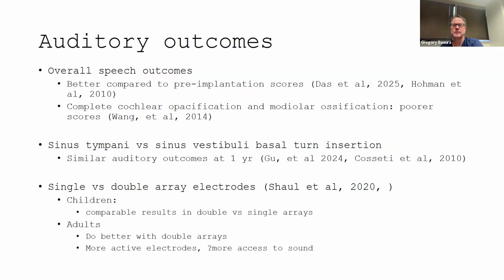I've only had a few cases with temporal bone trauma. In one, the patient was okay, got the films, was cleared for an implant, and we did that. I had one case of a 15-year-old who had an ATV, like a four-wheeler accident, and crashed into a tree and had bilateral transverse temporal bone fractures right through the otic capsules. Fortunately, I was able to get him evaluated, cleared for implants, and taken to the OR within 1 month. Within that month of the trauma, he already had fibrosis in the cochlea. Those were almost pseudo drill outs. It was incredible the amount of fibrosis that was already within the cochlea within 4 weeks.